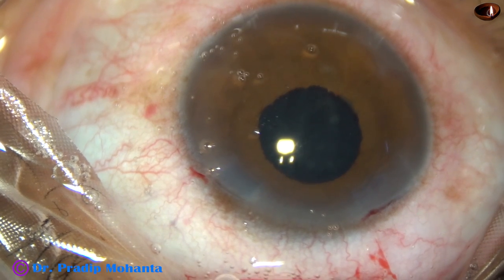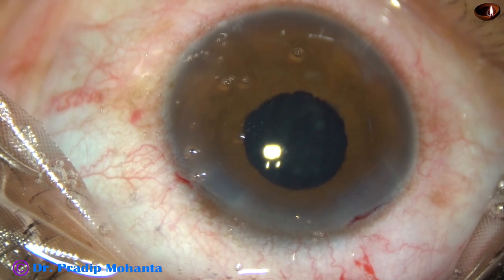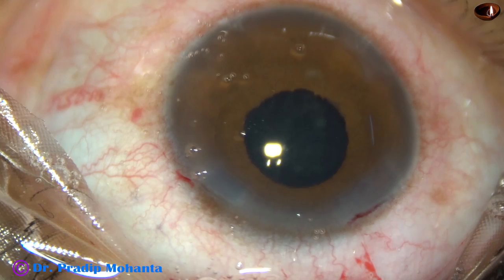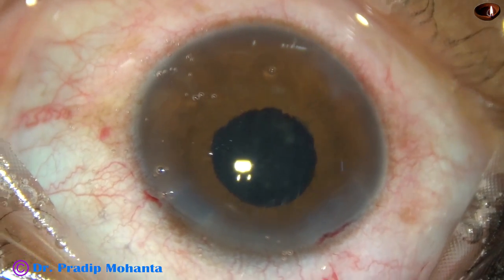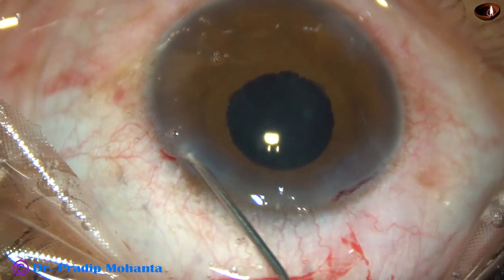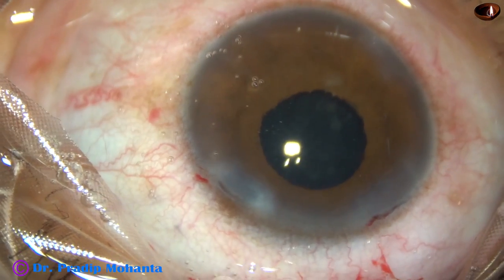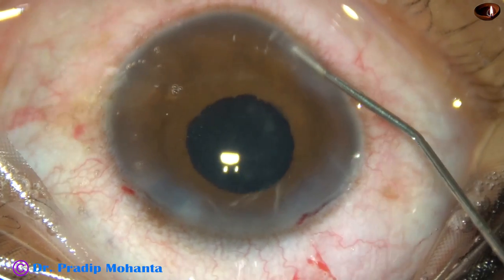Now you can see a round pupil. Why? Because there is no damage to the sphincter pupillae. When we apply iris hooks, we tend to pull them as much as possible, and in that process we tear off some iris sphincter, and the pupil takes a shape which is not cosmetically good.